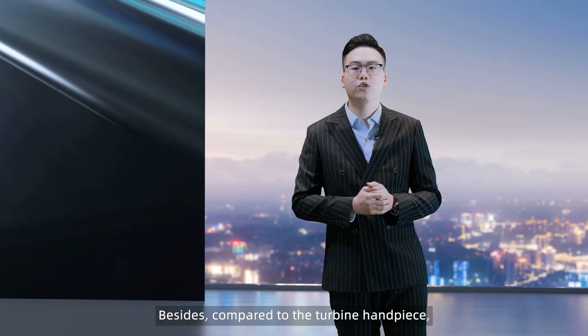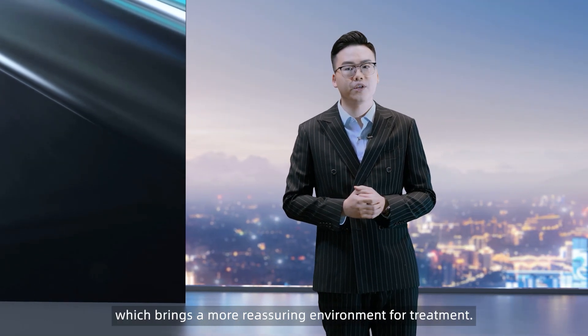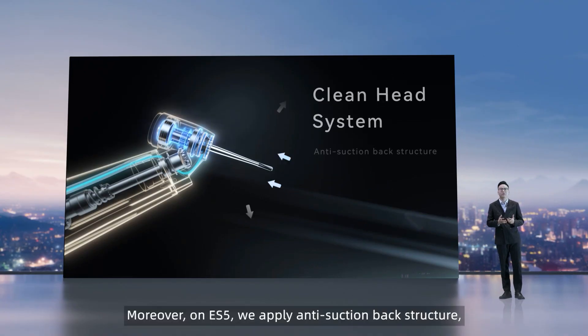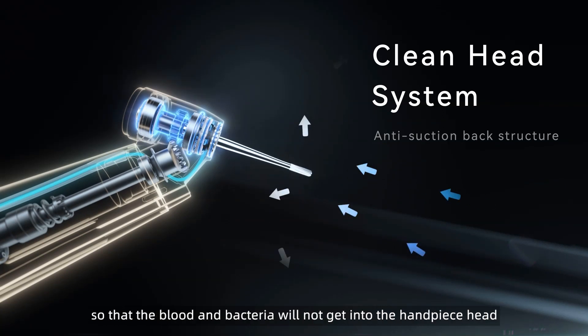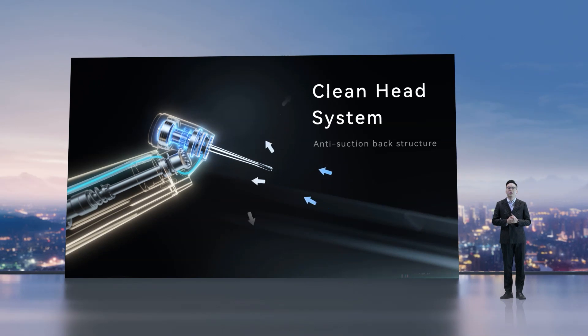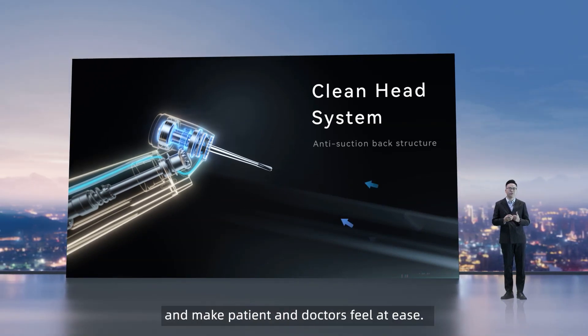Besides, compared to the turbine handpiece, ES5 can reduce more than 50% of aerosols, which brings a more reassuring environment for treatment. Moreover, on ES5 we apply an anti-suction back structure so that blood and bacteria will not get into the head of the handpiece, thus avoiding cross-infection and making patients and doctors feel at ease.